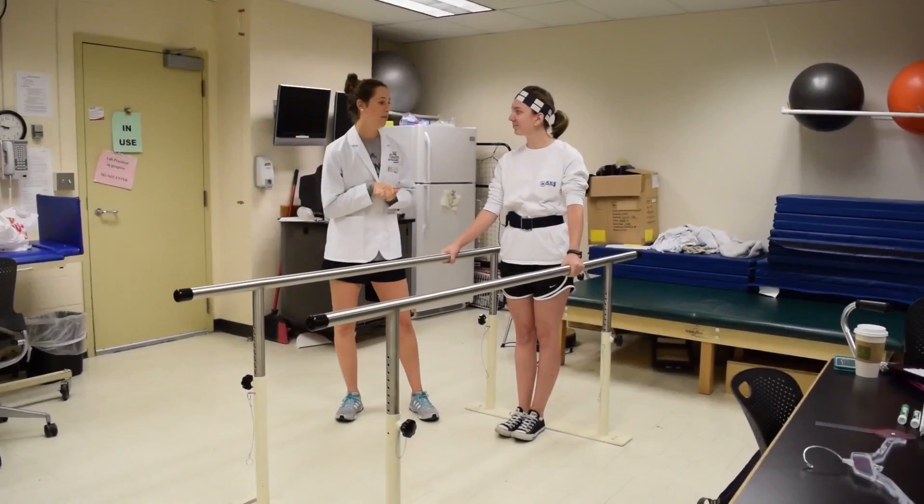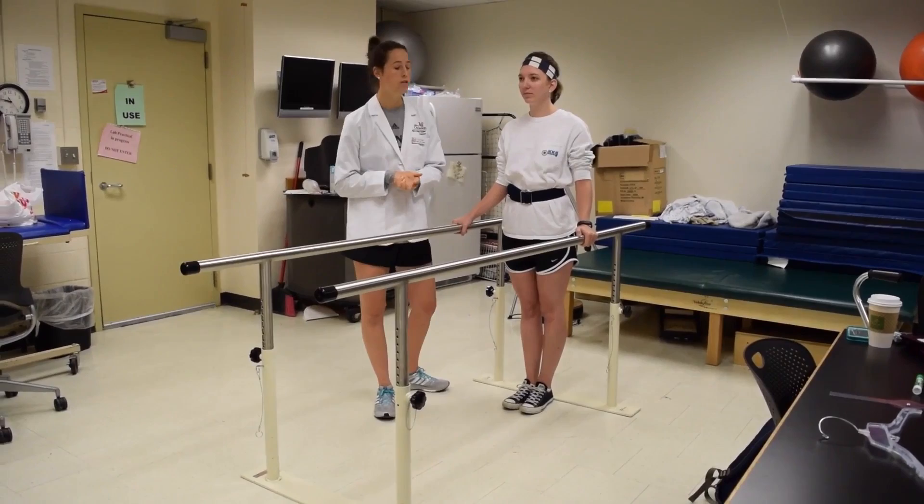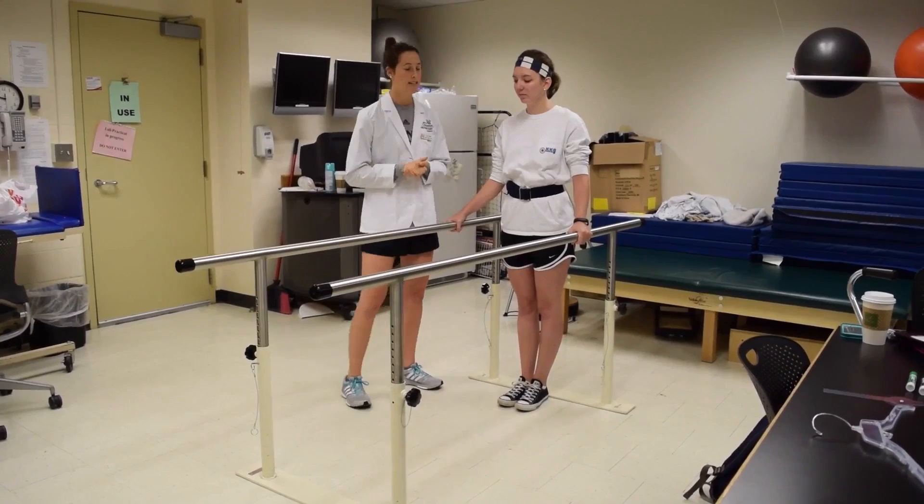I am a physical therapy student at UC. I've already fully introduced myself to Courtney before getting started with any of our activities. I thoroughly washed my hands and all of our equipment has been washed for use. I've explained what we're going to be doing to her today, and she has consented to the treatment that we are going to do.